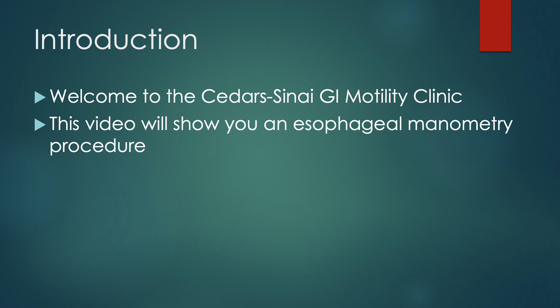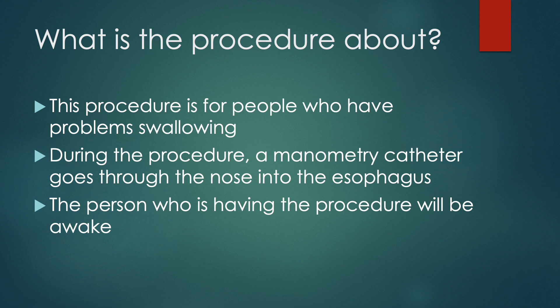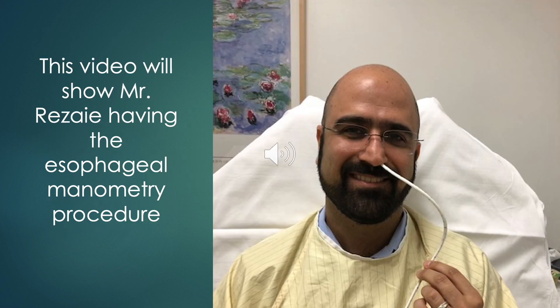Welcome to the Cedars-Sinai GI Motility Clinic. This video will show you an esophageal manometry procedure. This procedure is for people who have problems swallowing. During the procedure, a manometry catheter goes into the nose and into the esophagus. The person having the procedure will be awake. This video will show Mr. Rizzai having the esophageal manometry procedure.